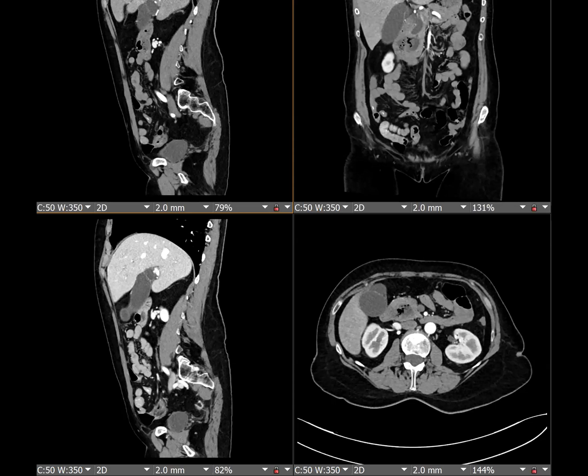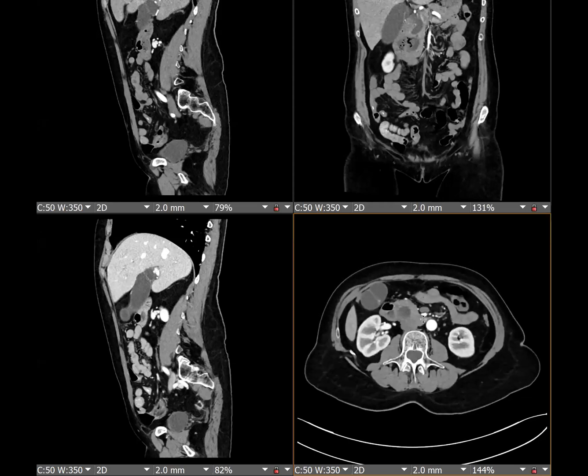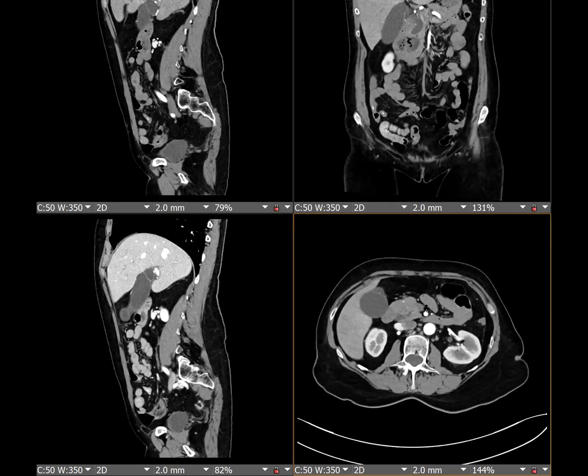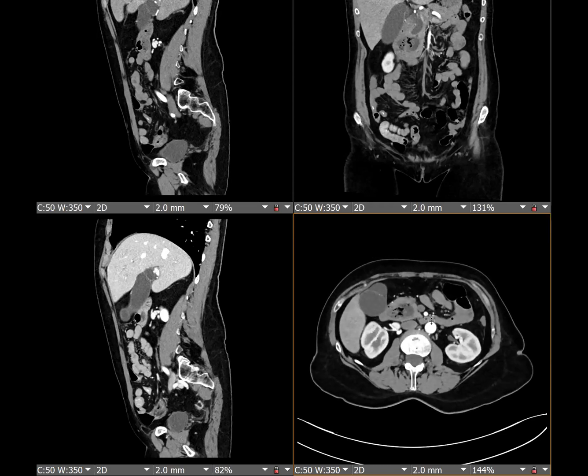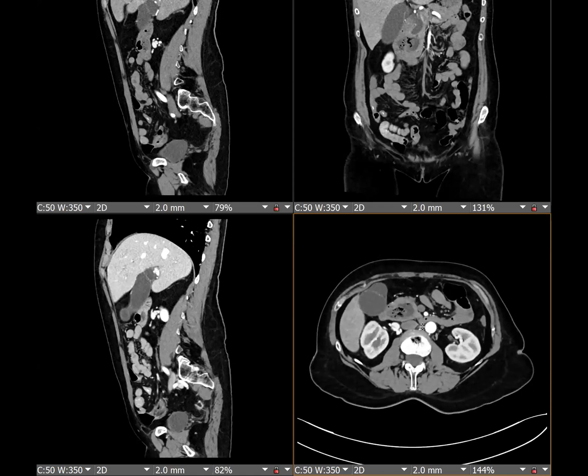This was a diverticulum. It actually was a duodenal diverticulum that had inspissated material in it. Previous to this, this diverticulum had caused pancreatitis, which was treated conservatively. This was a second follow-up visit. When we were looking at this, we thought maybe some ingested material or a bezoar type of material or something that got stuck here.